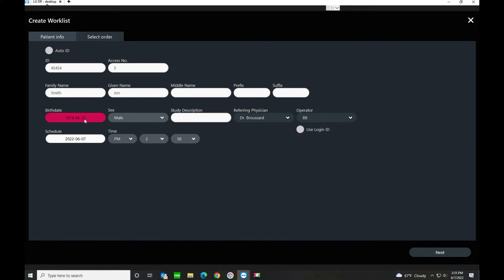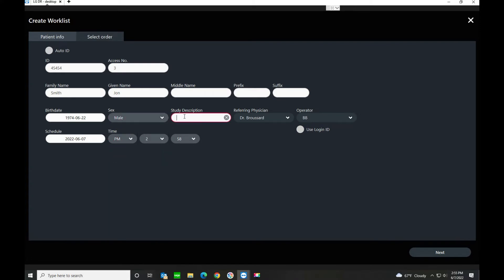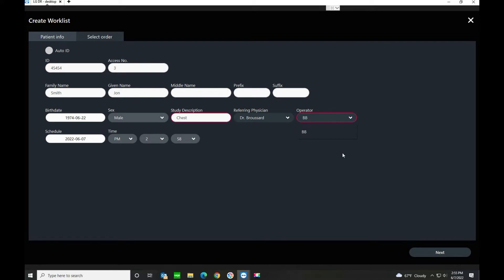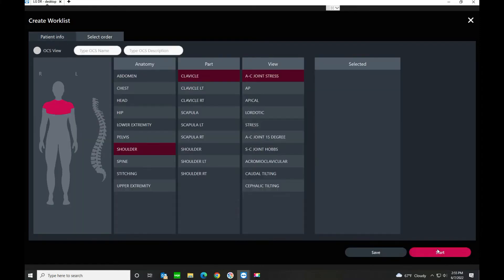Now you can see the birth date has been changed. We've got sex preferences — male, female, other — we'll go with male. Study description, we'll say chest. The referring physician field is a learning field, so as you type in new doctor names it'll build a list and you can just select from there instead of typing it each time. The operator field works the same way. Now we'll click Next.